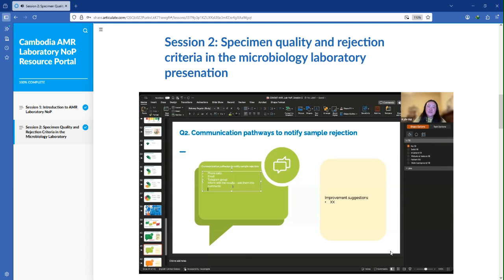For example, with sputum cultures, if we read the gram stain to determine how many epithelial cells were in the specimen, you would already have some type of result. So you'll have all your gram stain results, and then in the comments, when you decide that you are not culturing this sputum sample, you'll note that this sputum was inappropriate for culture or something like that.